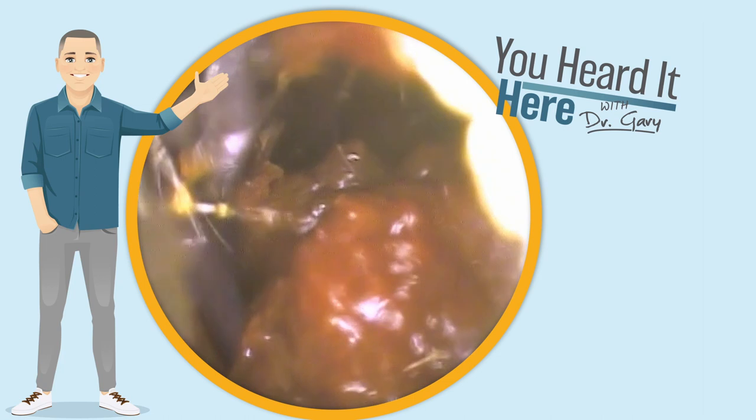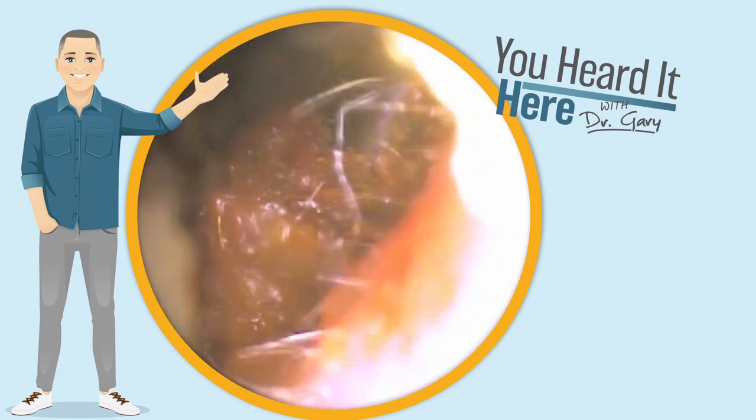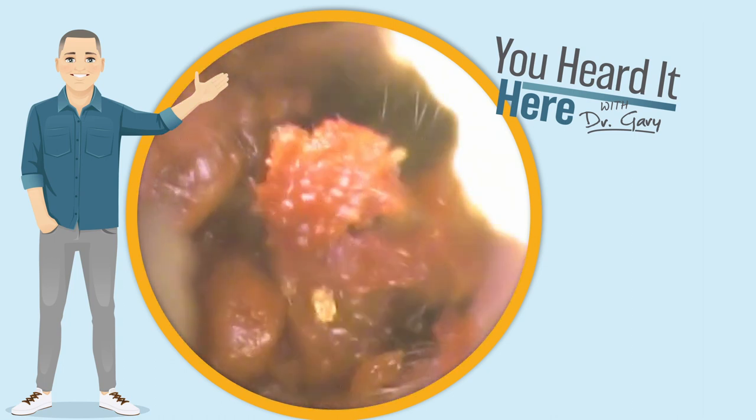This is a longtime patient who really enjoys the irrigation, so even though it wasn't necessary, it's the method that they prefer most and they always like when we finish the ear cleaning with a little bit of irrigation.